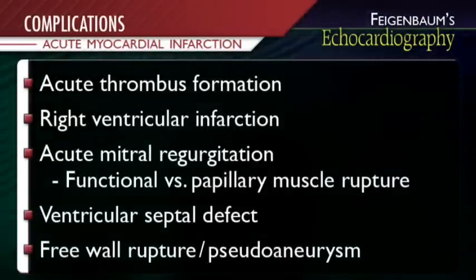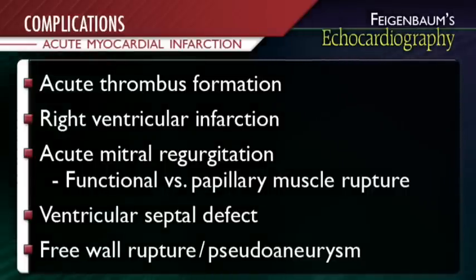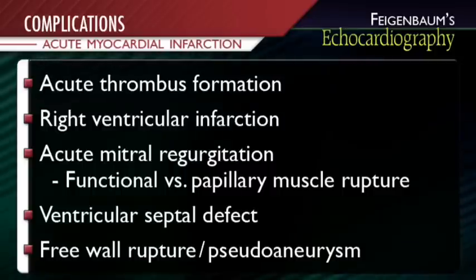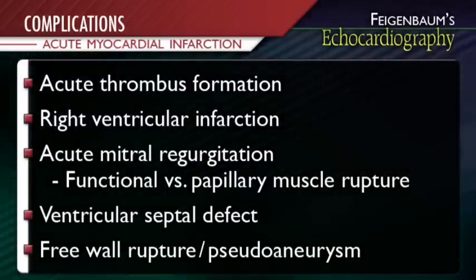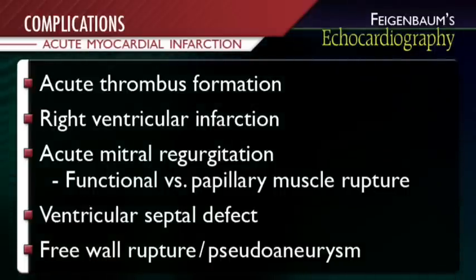Echocardiographic techniques can detect the vast majority of mechanical complications of myocardial infarction, including thrombus formation, right ventricular infarction, mitral regurgitation, both functional and related to papillary muscle rupture, acute ventricular septal defect, and pseudoaneurysm.